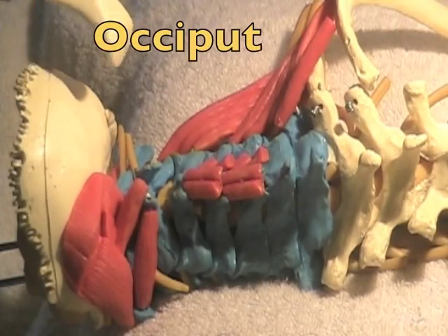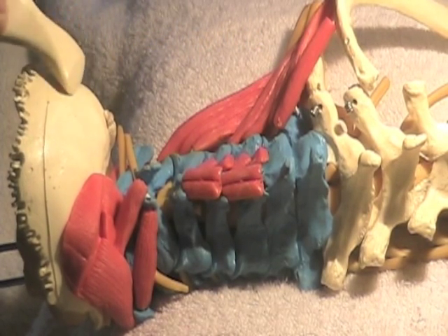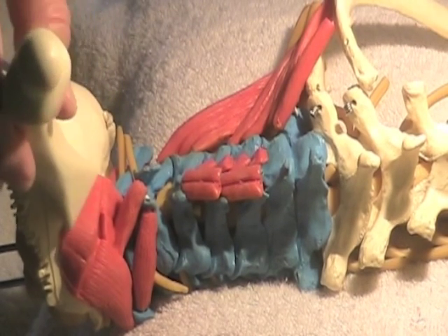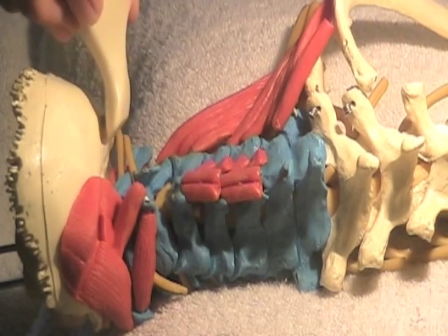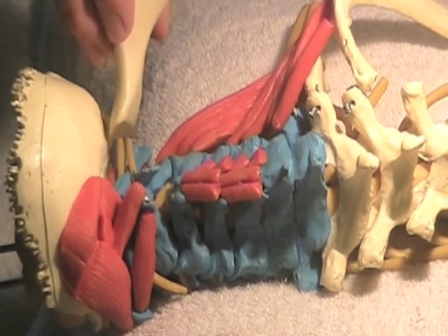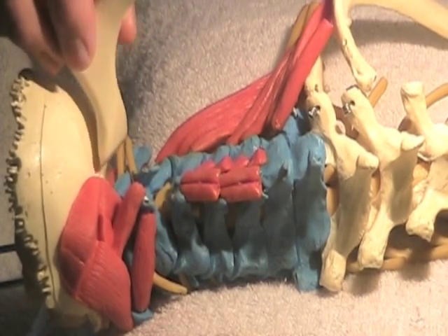This little tool can be used very effectively to scoop right up underneath the occiput on the head. The difference between a patient getting better and just getting improvement is how firm you are. This little tool will reach up into the suboccipital muscles into areas that you can never get your fingers into. Of course, if you don't release those areas and trigger points are in there, they will keep reactivating the muscles to tighten up.